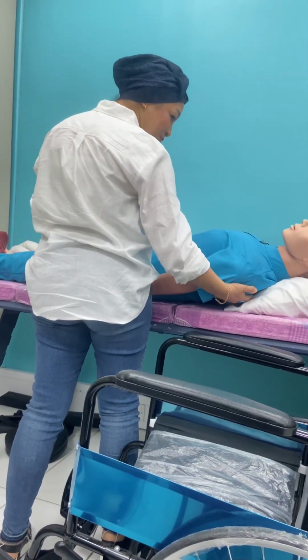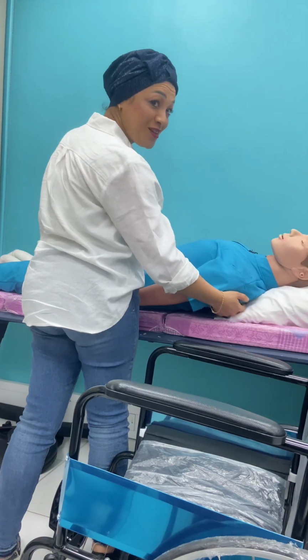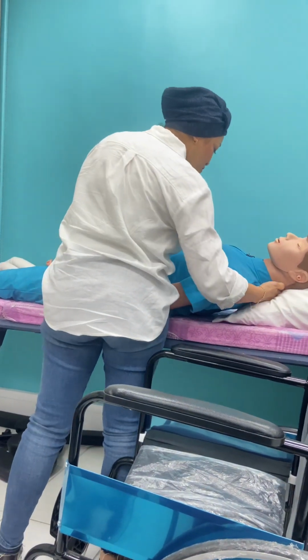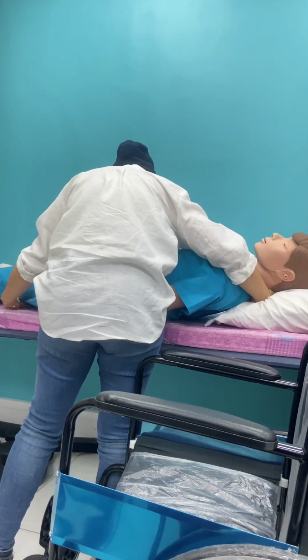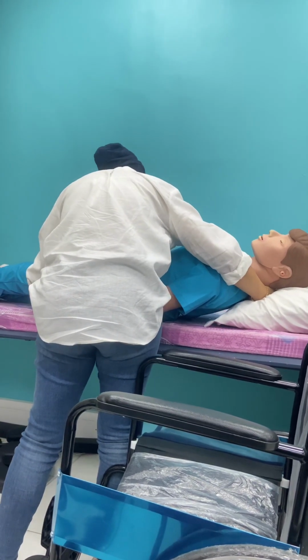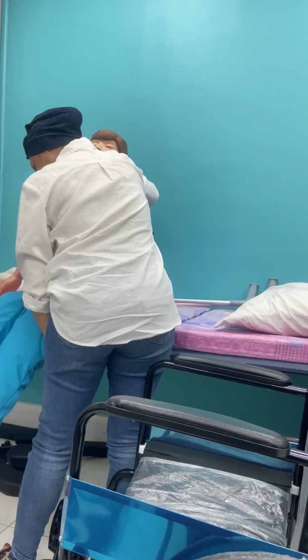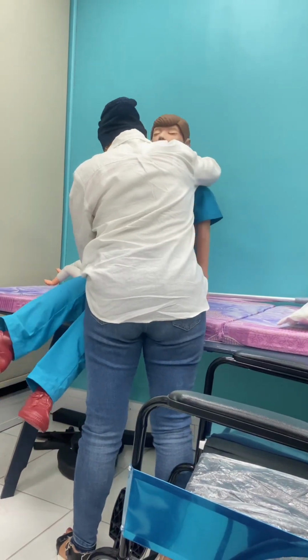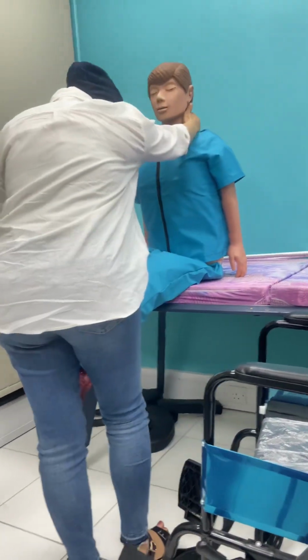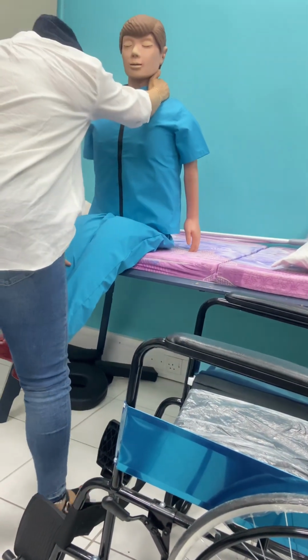Then, Mr. Mustafa, we are going to move. In one move only, I'm going to lift you up in a sitting position and then put your legs down. So one arm has to support his neck and the other one supports his legs. So 1, 2, 3. Very good. 4. We said sitting. Don't jump. Sitting.